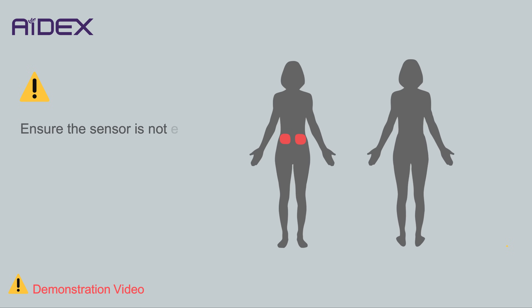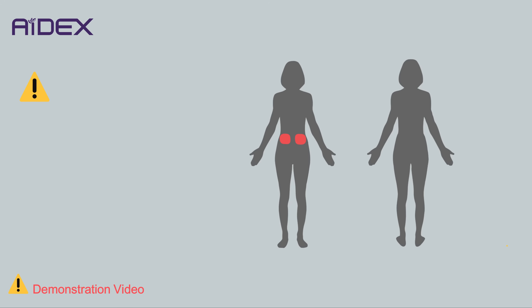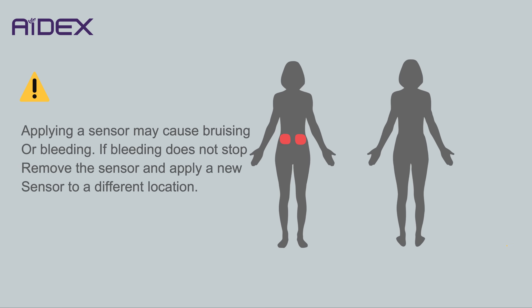Ensure the sensor is not expired by checking its expiration date. If the sensor is expired or the sterilized package is damaged, please do not use it. Applying a sensor may cause bruising or bleeding. If bleeding does not stop, remove the sensor and apply a new sensor to a different location.